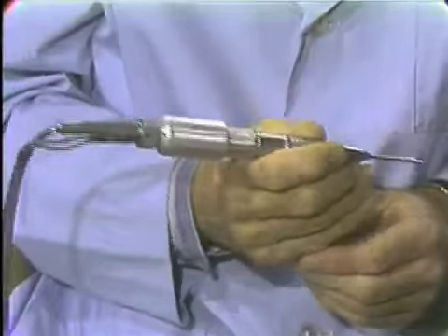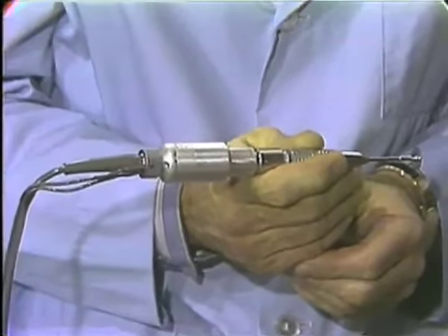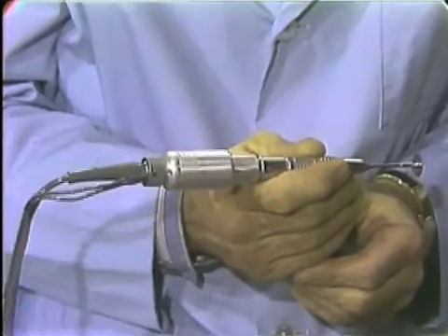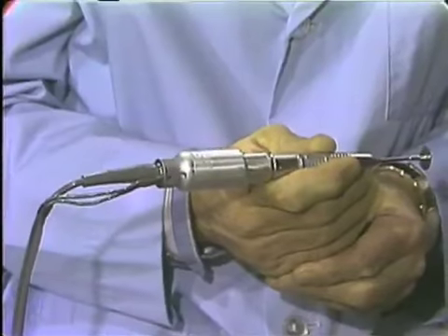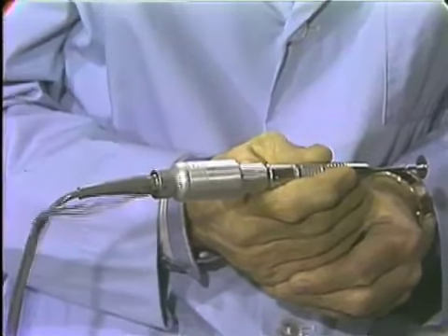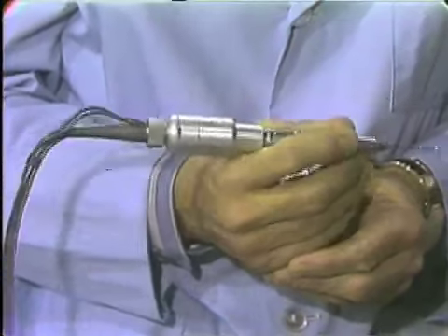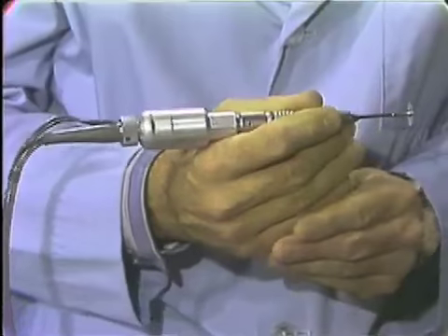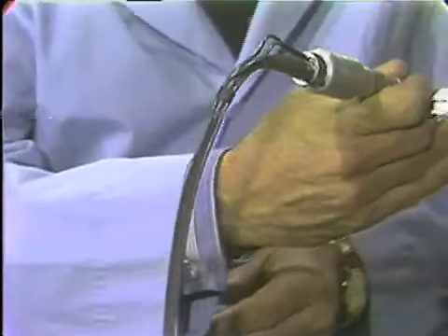It is extremely important to realize the way your instruments work. This is true whether it's in a slice or not. And in this case, with this instrument, one should realize that as we turn on the engine, there is a sudden surge, and we do not get a smooth start many times. This could be rather disastrous if it would catch in the mouth or outside the mouth. I will demonstrate this by turning on the unit. Did you notice the sudden jump of the motor? So be ready for this. One should be right onto it and holding very tightly with a firm finger pressure onto the engine and in the mouth.